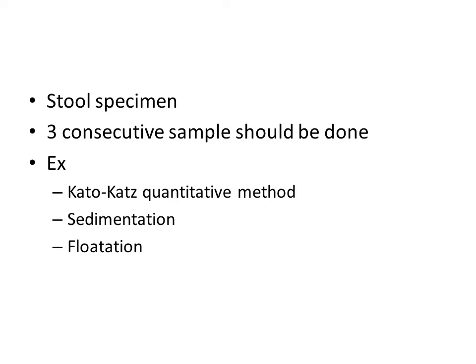Right, when we consider the stool specimen, we have to use 3 consecutive samples.